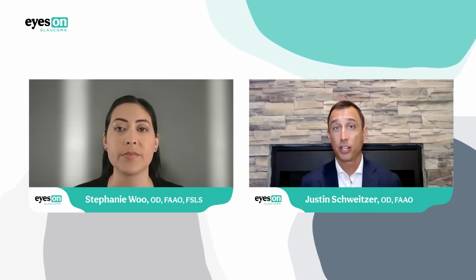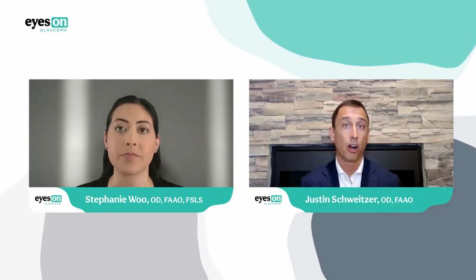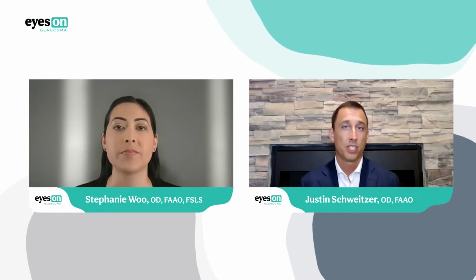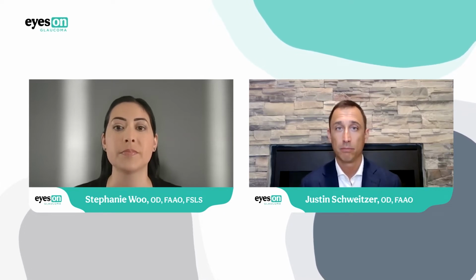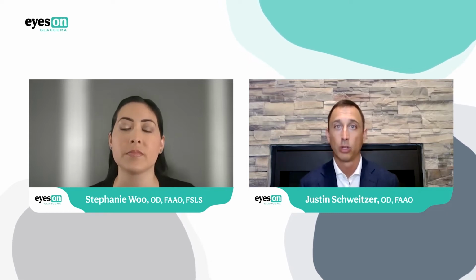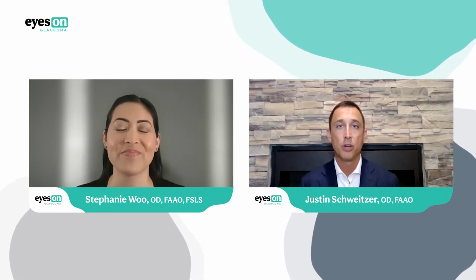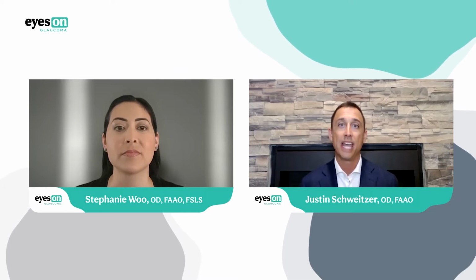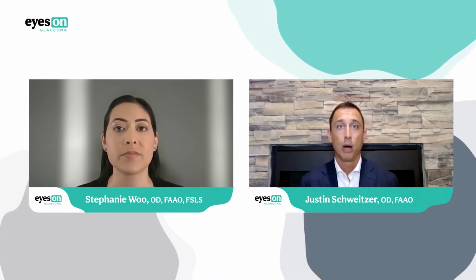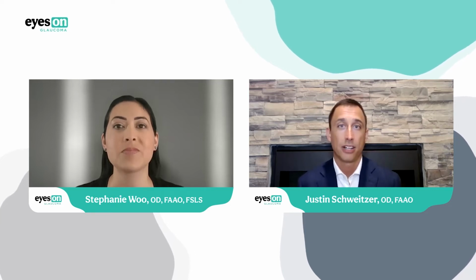I think it depends on your clinic a bit. I'll give you an example. In our clinic, we have 3 visual field machines, and they're in specific rooms and they take up some area. And I love my visual fields. I look at this as an adjunct to those visual fields. I don't think we'll ever stop using those. But the beauty of this is when a technician tells me, hey, we're backed up 2-3 patients or even a patient, I won't hesitate to utilize a technology like this.